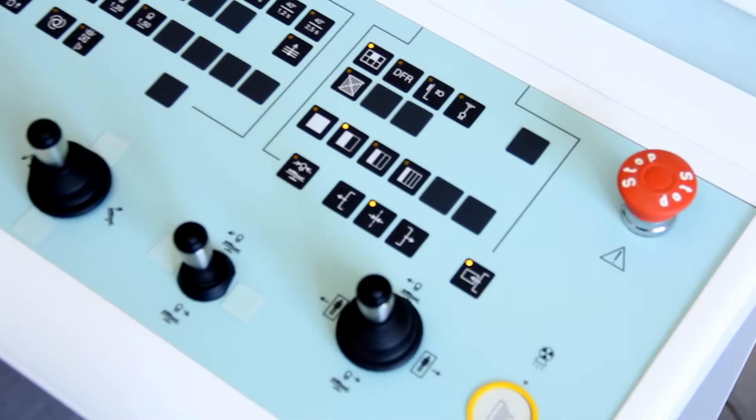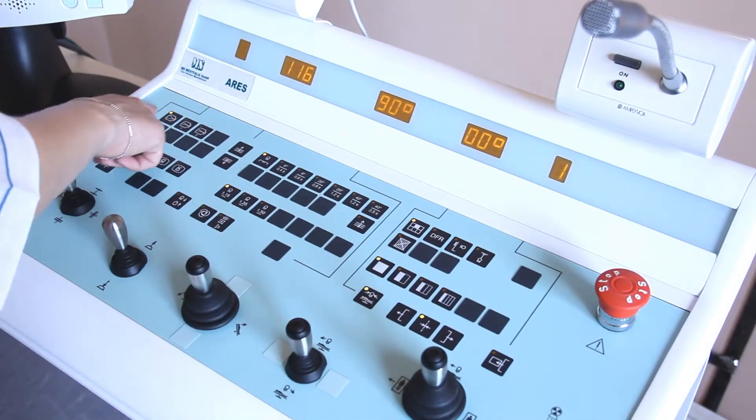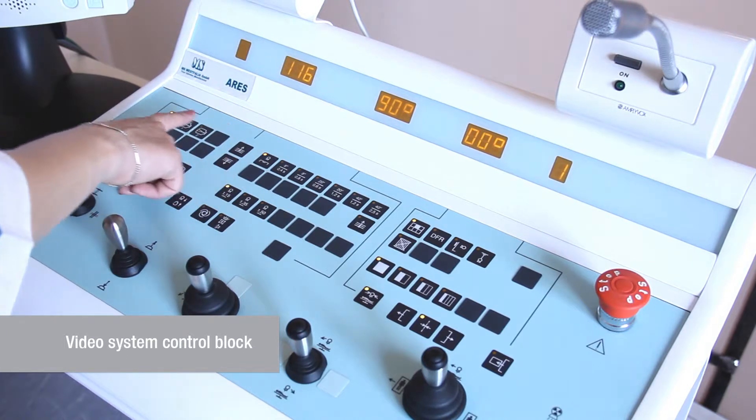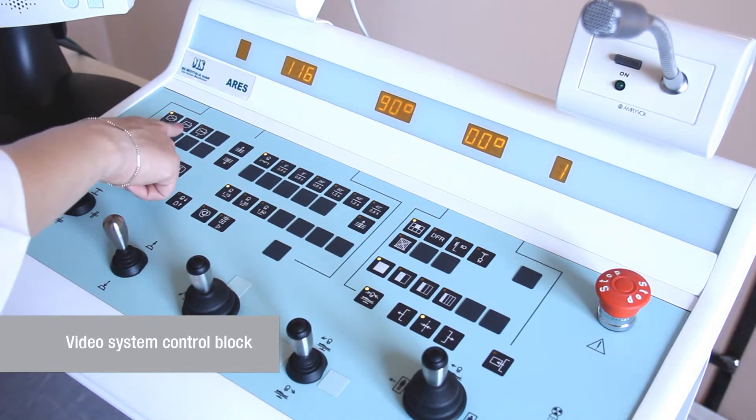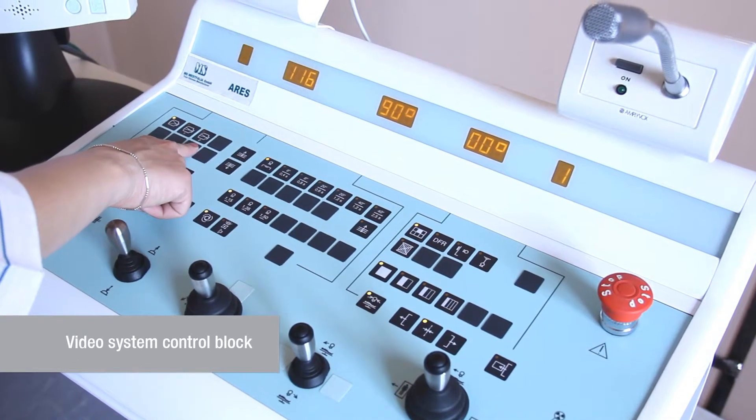The remote control panel includes a video system control block with size adjustment of the working field, a main field, and the first and second additional fields.